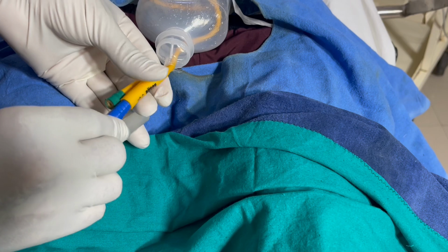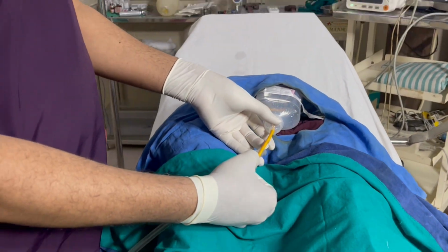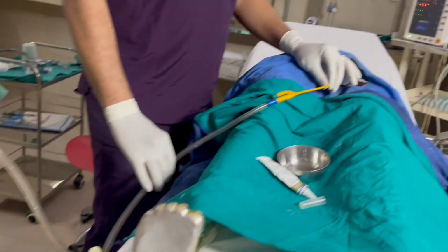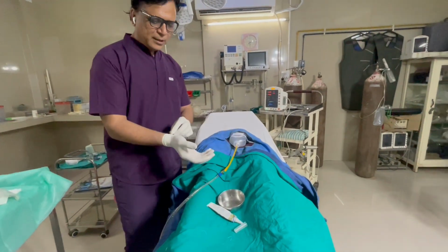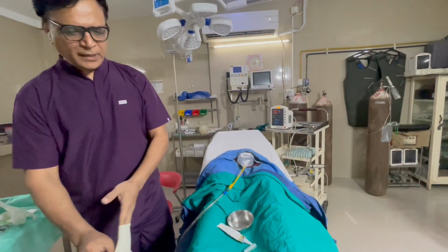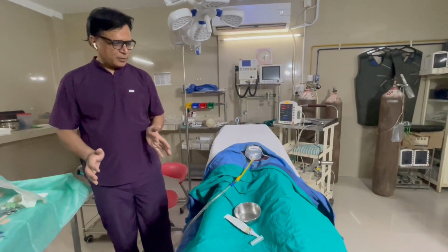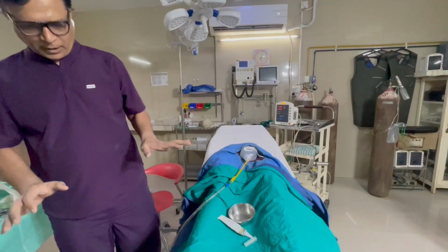So the urine will be collecting, and I try to pull the catheter gently. Then again I put the prepuce back, and the urobag is connected, and then I will dispose of the gloves and all the items into the waste. So once the catheterization is done, I will check the urine output and see if the person is having relief. Thank you.